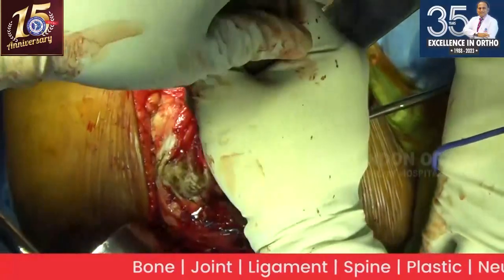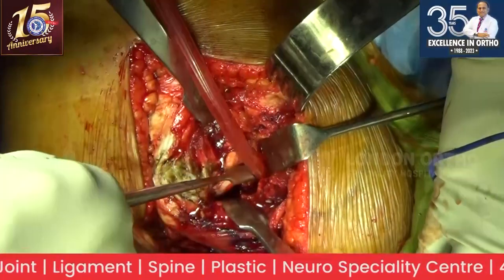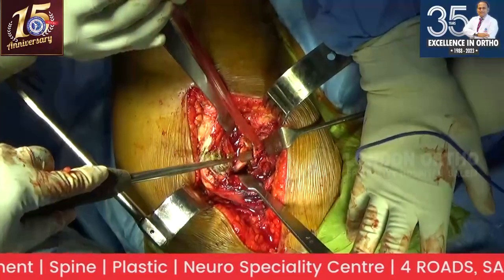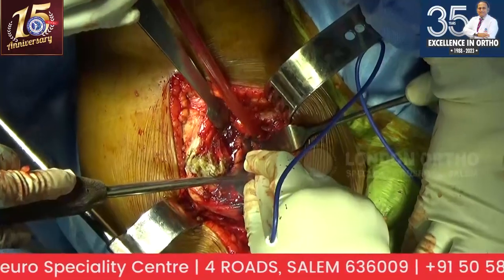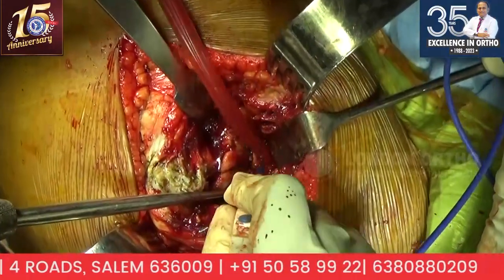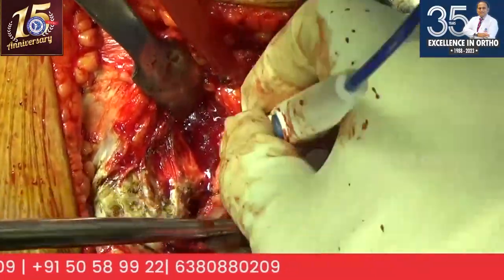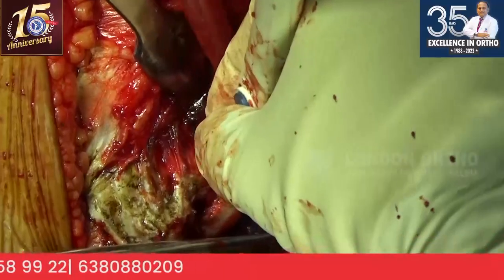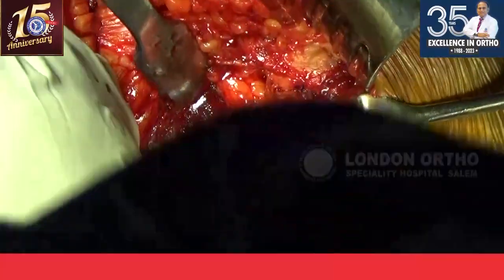This is the release I am doing extra in this case. And as we have discussed, Vignesh discussed this case in the X-ray templating. What we have here is nearly a 7-8 millimeter protruding osteophyte. The real floor is there. Okay, a small periosteal elevator, I tend to elevate it.